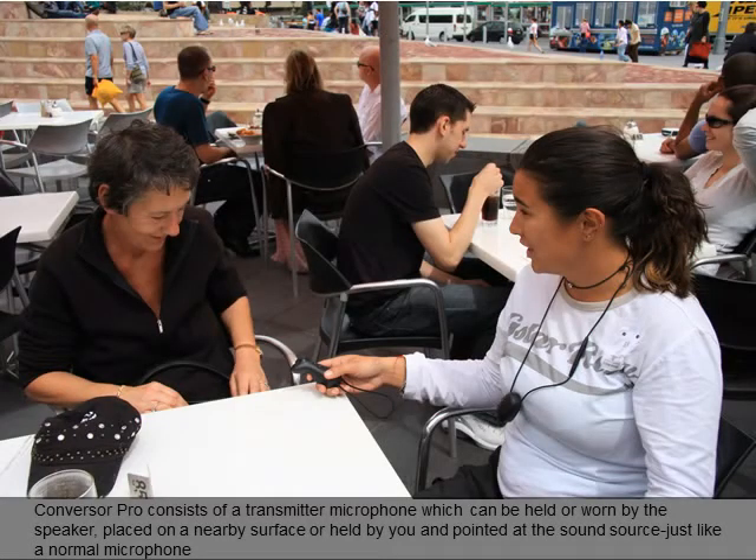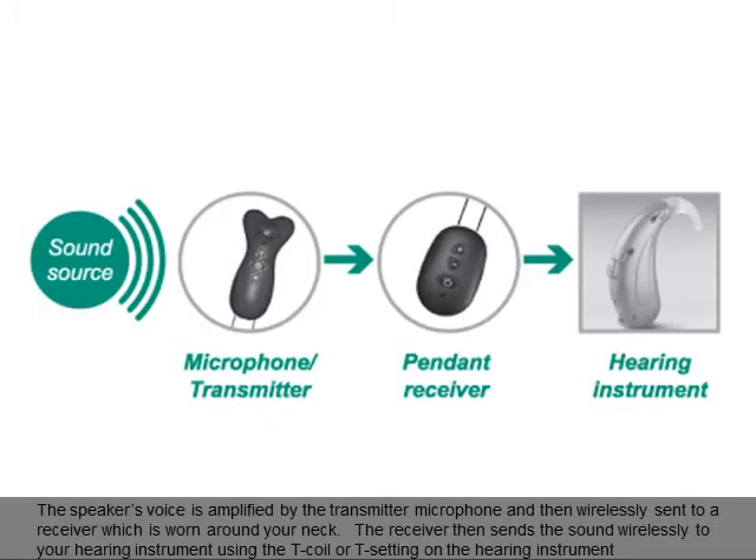Conversor Pro consists of a transmitter microphone which can be held or worn by the speaker, placed on a nearby surface, or held by you and pointed at the sound source just like a normal microphone. The speaker's voice is amplified by the transmitter microphone and then wirelessly sent to a receiver which is worn around your neck.